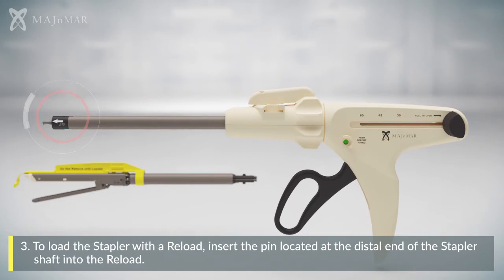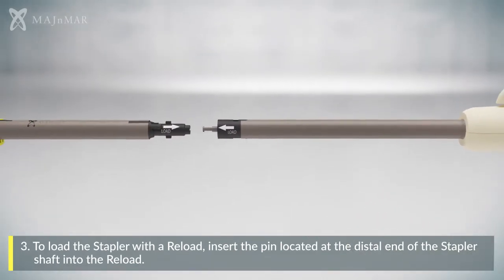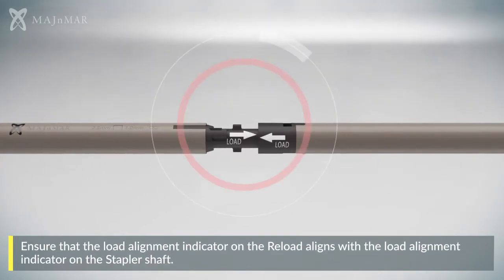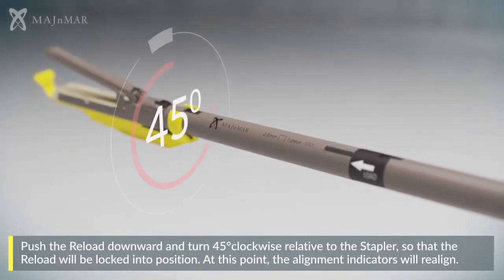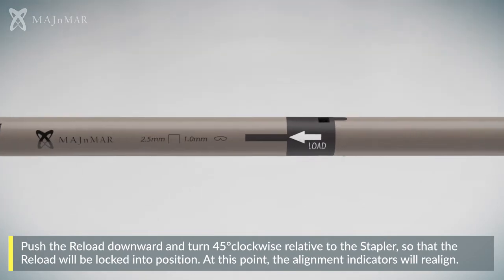To load the stapler with the reload, insert the pin located at the distal end of the stapler shaft into the reload. Ensure that the load alignment indicator on the reload aligns with the load alignment indicator on the stapler shaft. Push the reload downwards and turn 45 degrees clockwise relative to the stapler so that the reload will be locked into position.